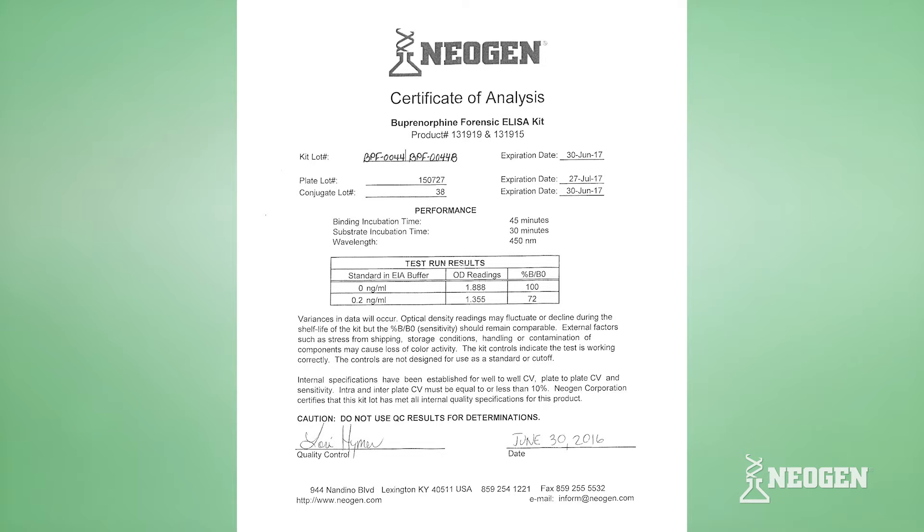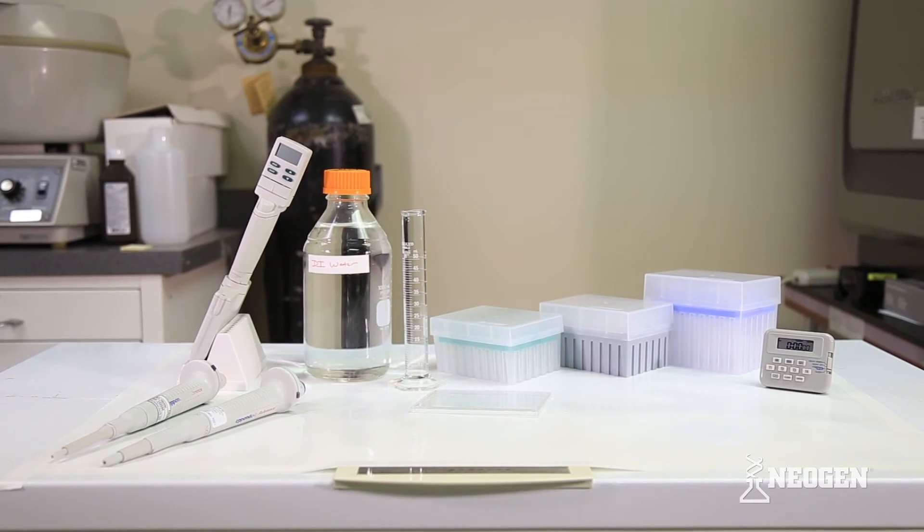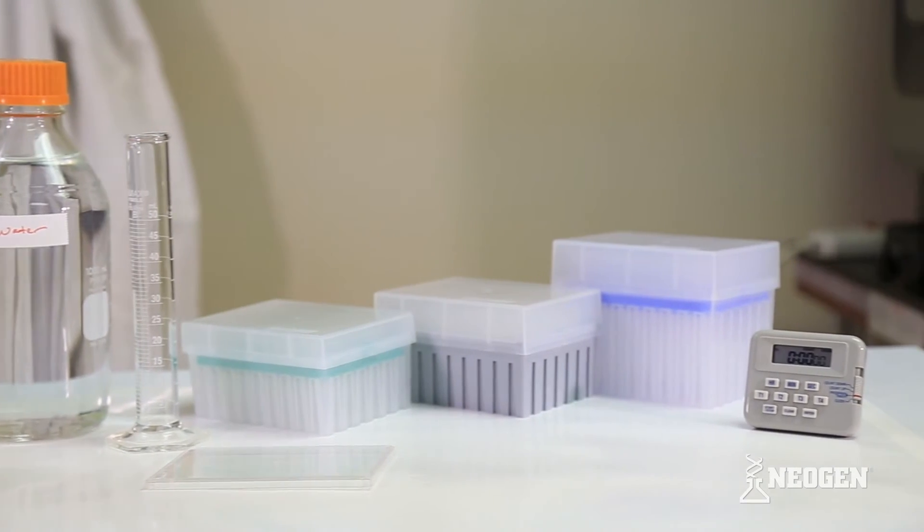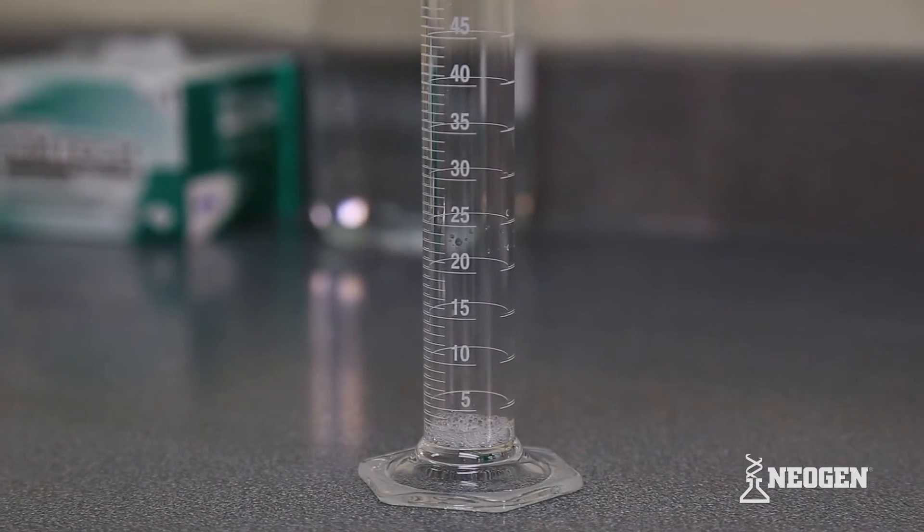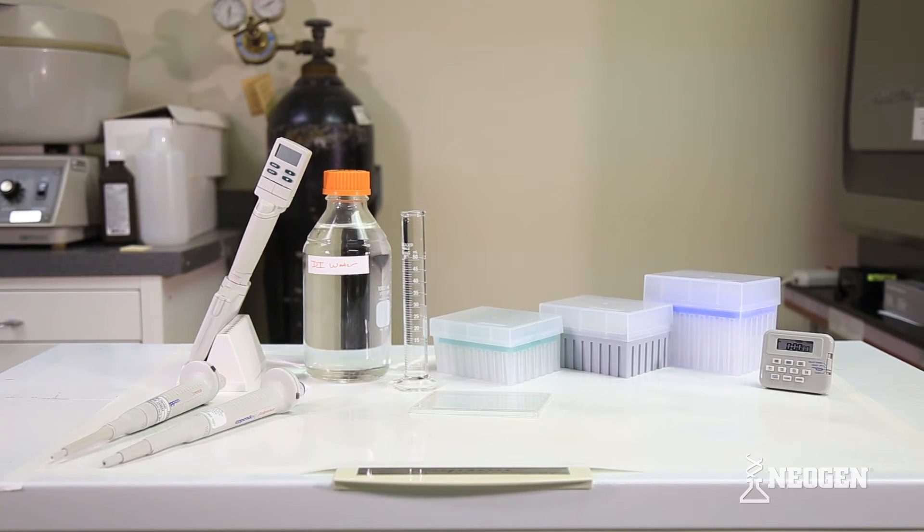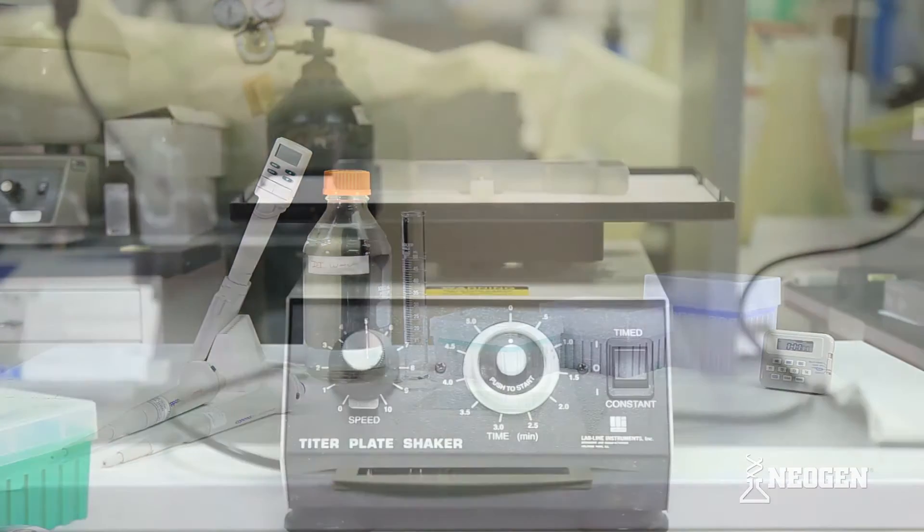Materials you will need but are not provided include deionized water, precision pipettes ranging from 10 microliters to 1,000 microliters, disposable tips for those pipettes, a graduated cylinder to mix the wash buffer, a plate cover, glassware, a microplate reader with a 450 nanometer filter, and, optionally, a microplate shaker.